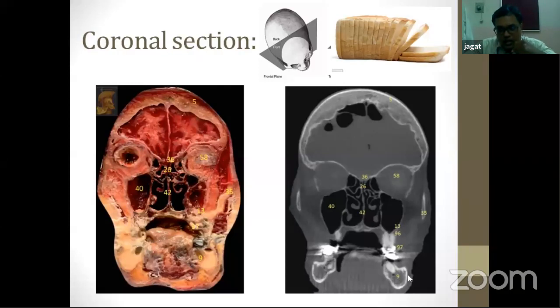In the coronal section, if you look at the mandible, it's fantastic. You are getting a buccolingual relationship here. This is one of the important relationships that we do not tend to see in the regular conventional radiograph. So this buccolingual relationship is something that is evaluable on the coronal section, right? So this is our coronal section for our understanding.